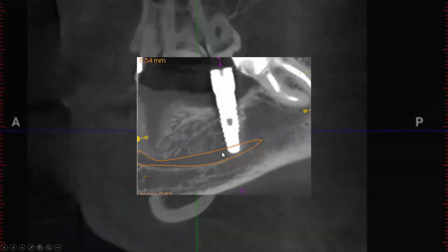All right, you can also trace the nerve with software to make sure you're avoiding the nerve. Sometimes the inferior alveolar canal is difficult to see. In a patient that's somewhat osteoporotic, it's really tough to see those borders, and you may lose the borders of the canal. And that's where I like to look back more distally, where I can see the nerve, and I start tracing it anteriorly.